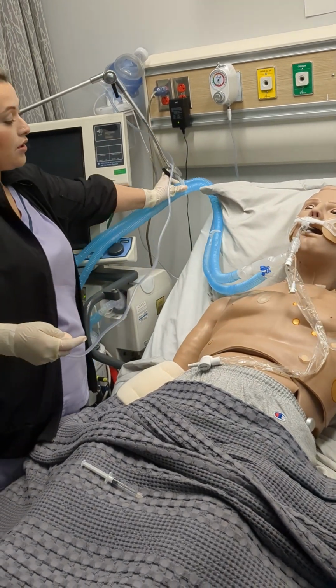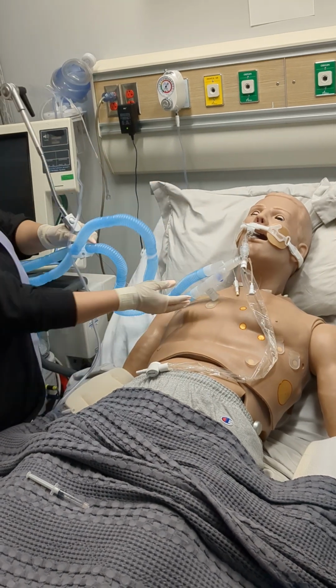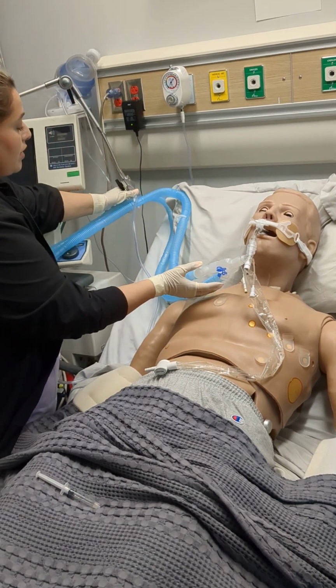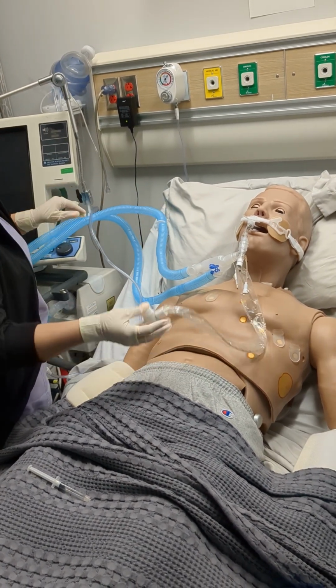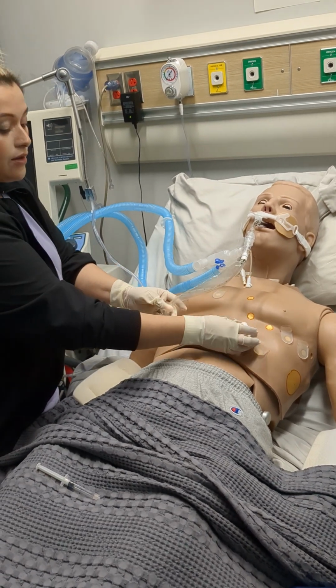You always keep your circuits out of the way before we start. You don't wanna leave the circuit here where it's in everybody's way. You wanna put the circuit out of the way where the patient can't grab it, okay? You're gonna lock this and we put the little blue cap, and leave that on the patient's chest.